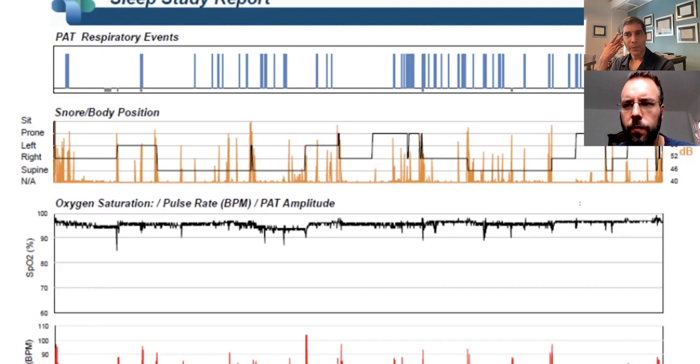Just like someone with epilepsy, they can even have an abnormality in their brain, but the seizures come in clusters. You have it for a few weeks, they disappear. Well, if it's all the plumbing, if it's all the abnormality, why wouldn't it just be steady all the time? The body's pretty complex. So I look for that cyclical clustering of snoring. Does that make sense? I look for that.